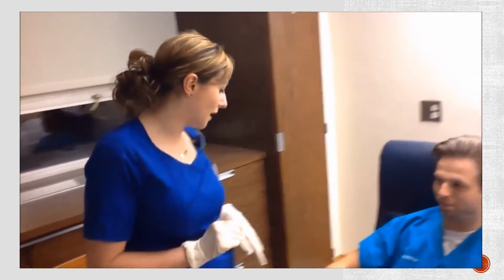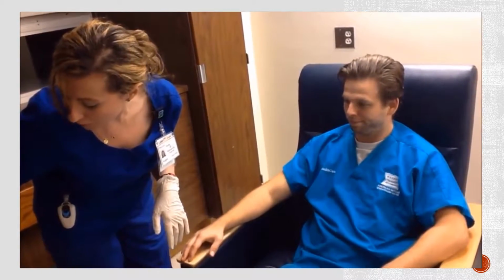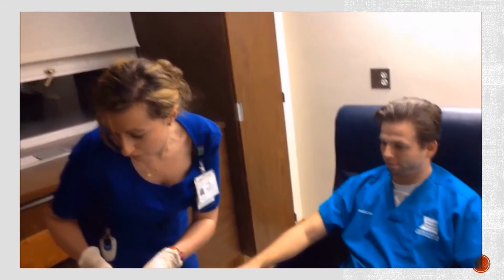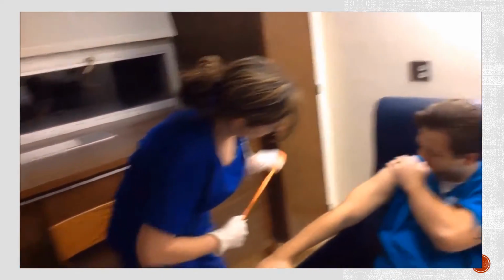Okay, I'm going to start by identifying a possible vein, and I'm going to apply the tourniquet. I have all my equipment ready. Got my piggyback tubing, my IV tubing primed and ready to go.